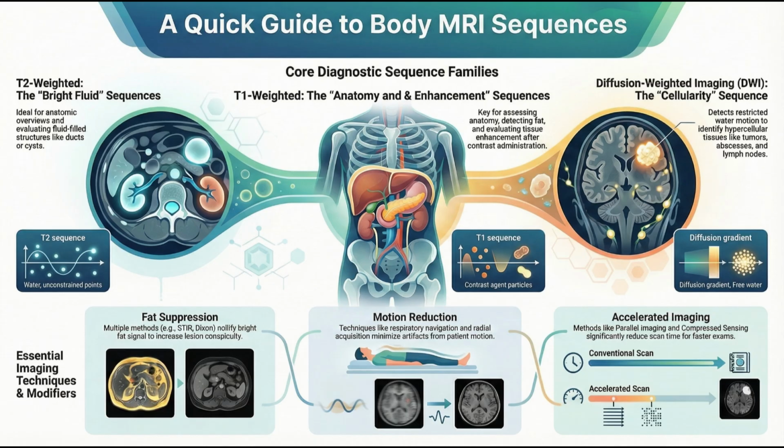That distinction is fundamental. And DWI gets notoriously messy near metal, like a hip replacement, especially at higher field strengths. What's the fix? Standard DWI is usually single-shot EPI, and it's terrible near metal. That's where you need something like readout segmented EPI, or RS-EPI. It breaks the acquisition into smaller, less distorted chunks. It dramatically reduces that geometric distortion and artifact. So you can actually see what's happening around the prosthesis. Yes. The trade-off is a slightly longer scan time, but it's a huge clinical win.